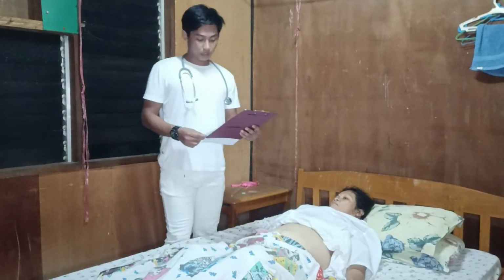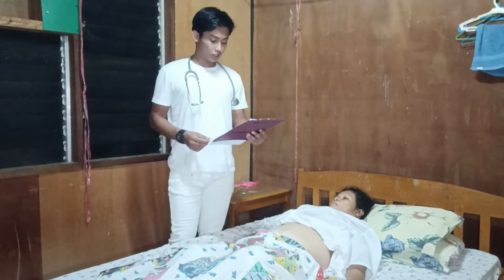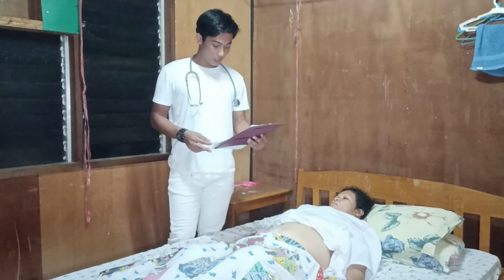Now for the peritoneal friction rub, use the diaphragm of the stethoscope to listen for friction rub over the liver and spleen.